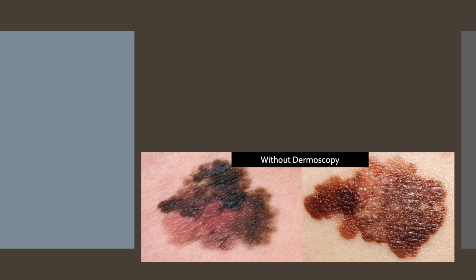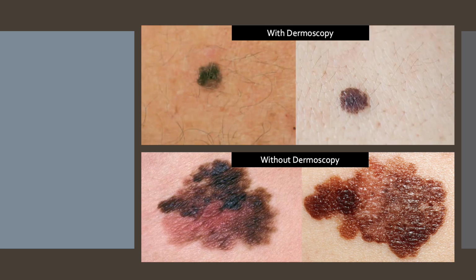So, if you diagnose a case of skin cancer at this stage without dermoscopy, with the help of dermatoscopes, you may be able to diagnose the patient much earlier. So it helps in early diagnosis of skin cancers.